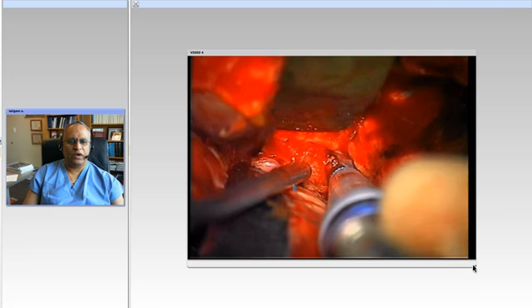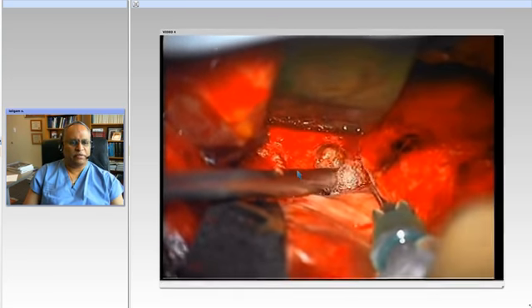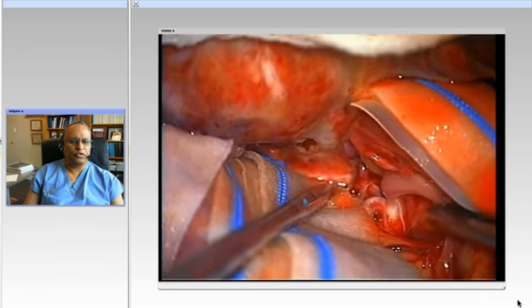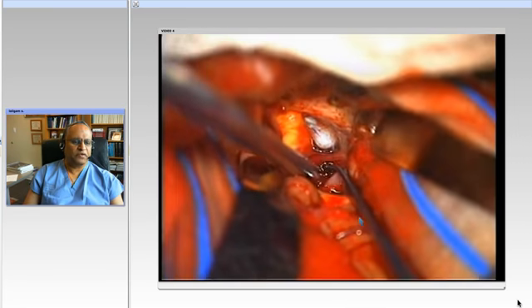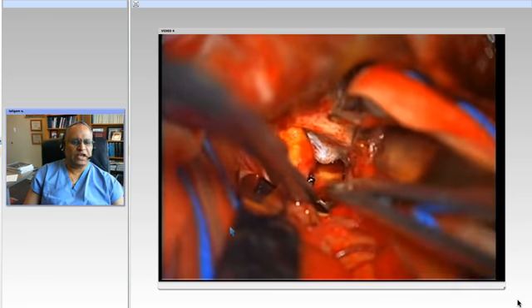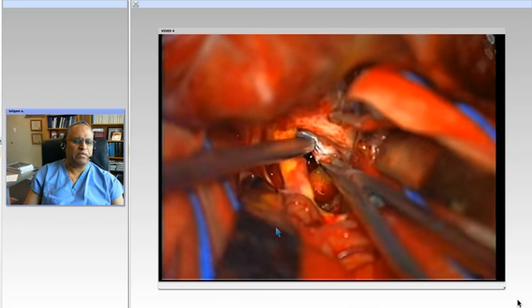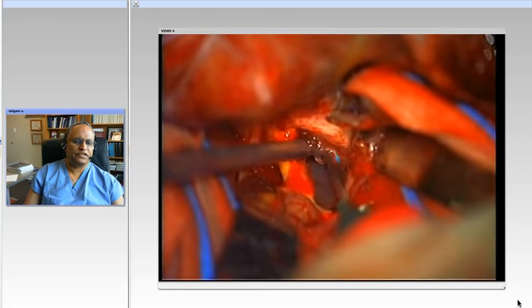So here now we are working on the right side, extradural clinoidectomy, and this is the extradural optic nerve decompression. I'm injecting a little fibrin glue in the cavernous sinus. This is the frontotemporal dura orbit. We've opened the dura, opening the Sylvian fissure. Here, the Sylvian fissure has been opened widely, middle cerebral artery. You can see a very sclerotic carotid artery. You see how sclerotic it is. And I've divided the PCOM, which is very minuscule in this patient. And this is the posterior clinoid process.